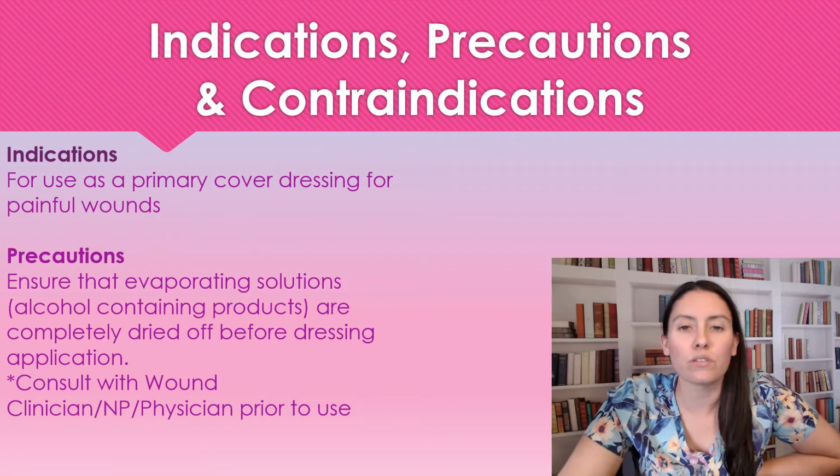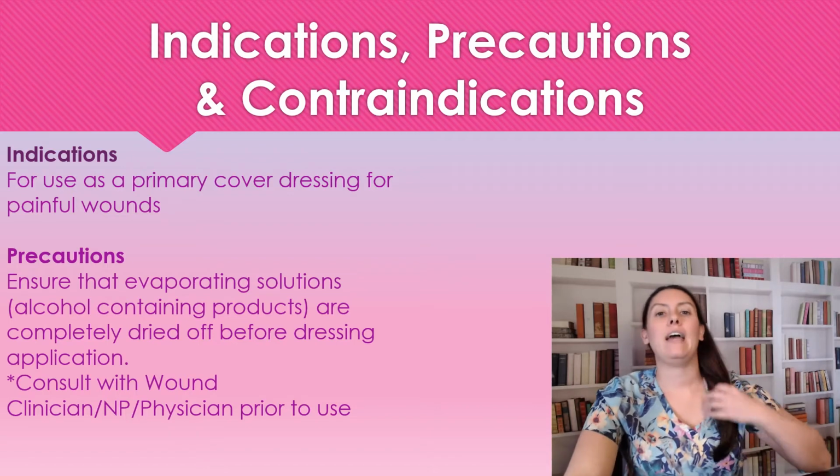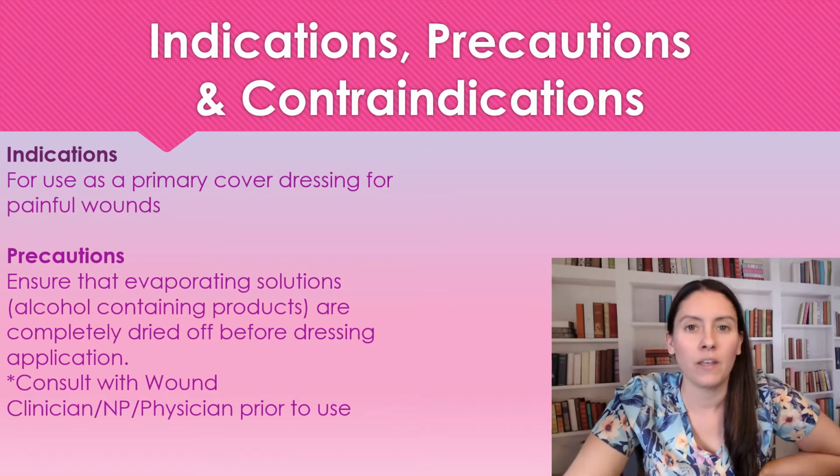Indication for use. So we're going to use this as a primary dressing for painful wounds. Some precautions. We want to ensure that any evaporating solutions, such as alcohol, are completely dry before applying this dressing. And we do want to consult with a doctor, nurse practitioner, or wound care specialist before using this dressing.